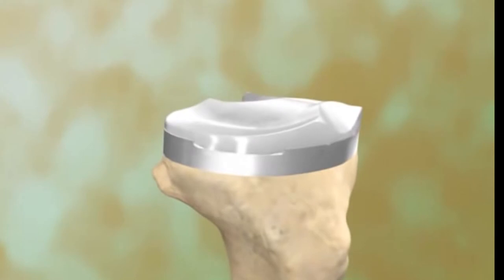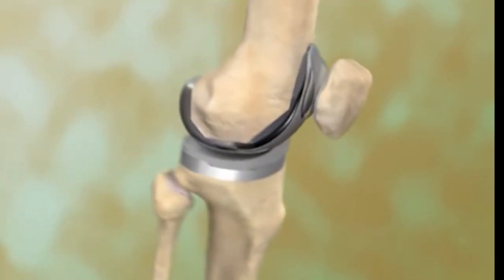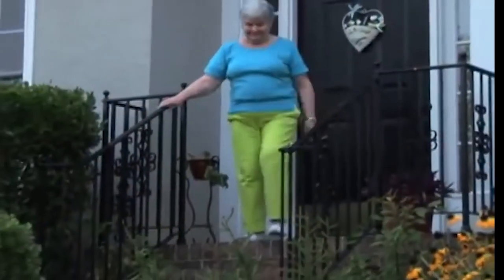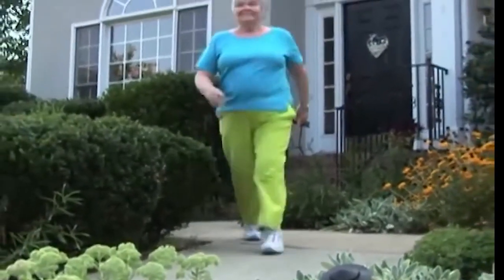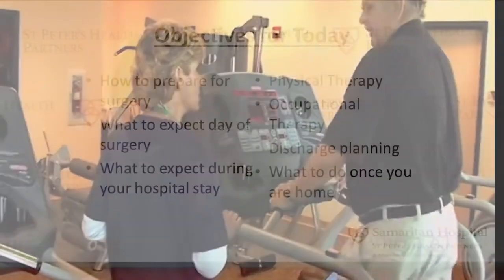The femoral component slides on it when the knee is bent. The damaged portion of the kneecap may be replaced by a mushroom-shaped prosthesis. The resectioned patella and prosthesis are attached to other components. Measurements and tests to ensure balance and movement are done during and after surgery. Knee replacement can significantly reduce pain and improve function. Like all surgery, there are associated risks. Physical therapy and realistic expectations are important for successful recovery.